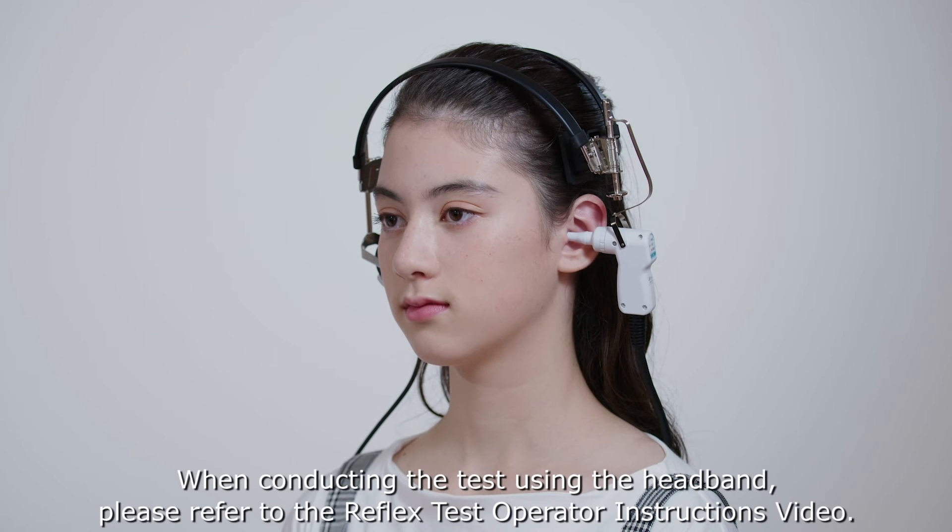When conducting the test using the headband, please refer to the reflex test operator instructions video.